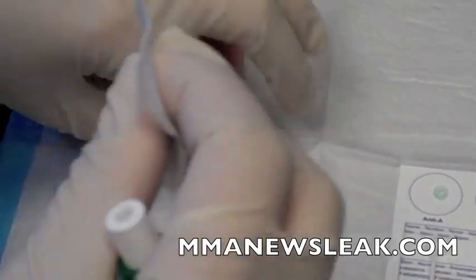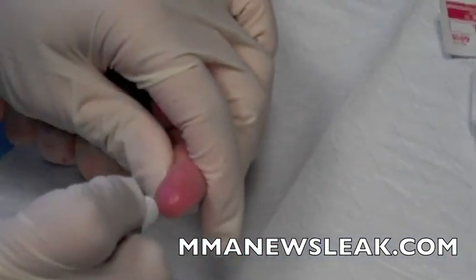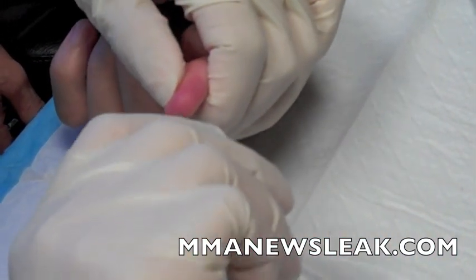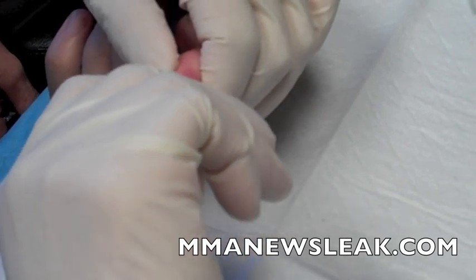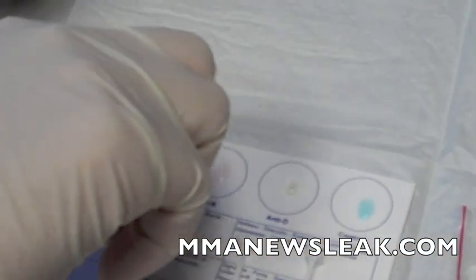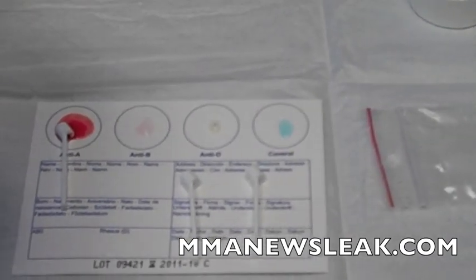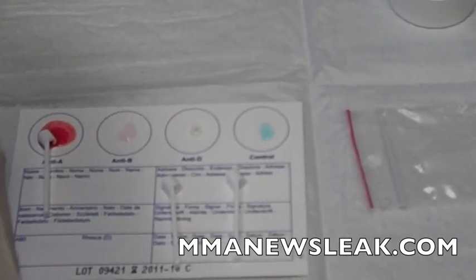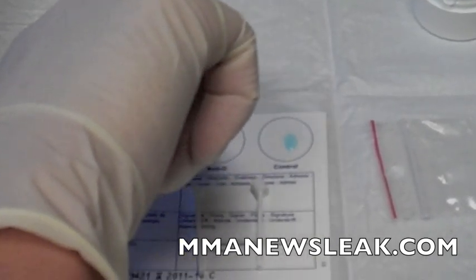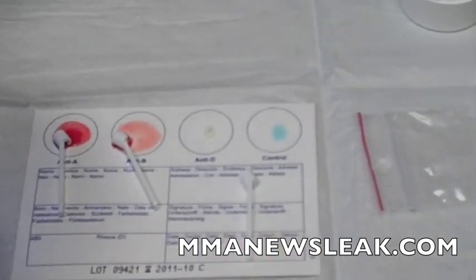I'm going to get the blood sample, wipe it down with alcohol, poke, and milk out some blood into each one of these little spoons, then mix it with the proteins that are on the card.